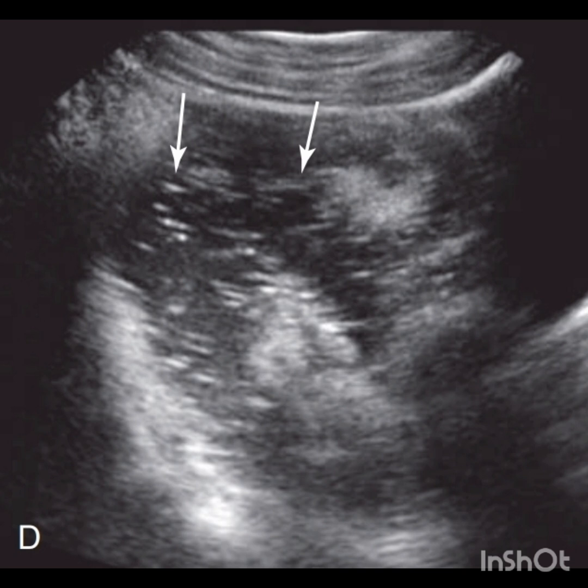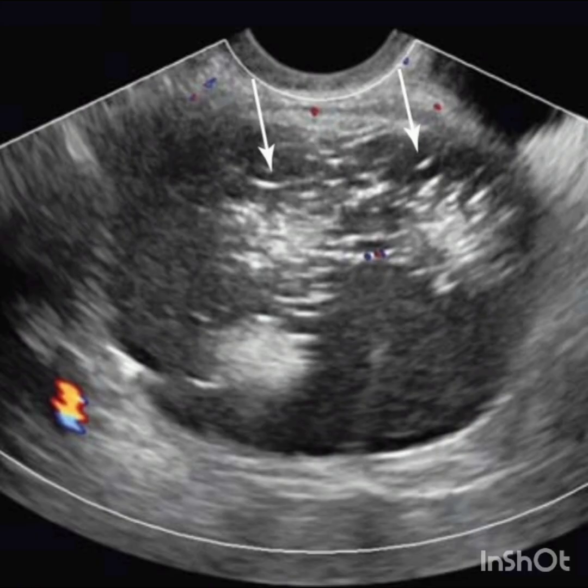This is another image of the dermoid cyst, and it shows what is called the dermoid mesh. In this, there are interlacing hyperechoic linear and punctate echoes indicated by the arrows, and it basically corresponds to the hair strands in the dermoid cyst. Now this is another image of the dermoid mesh, and you can see that there is no internal blood flow in the dermoid mesh.